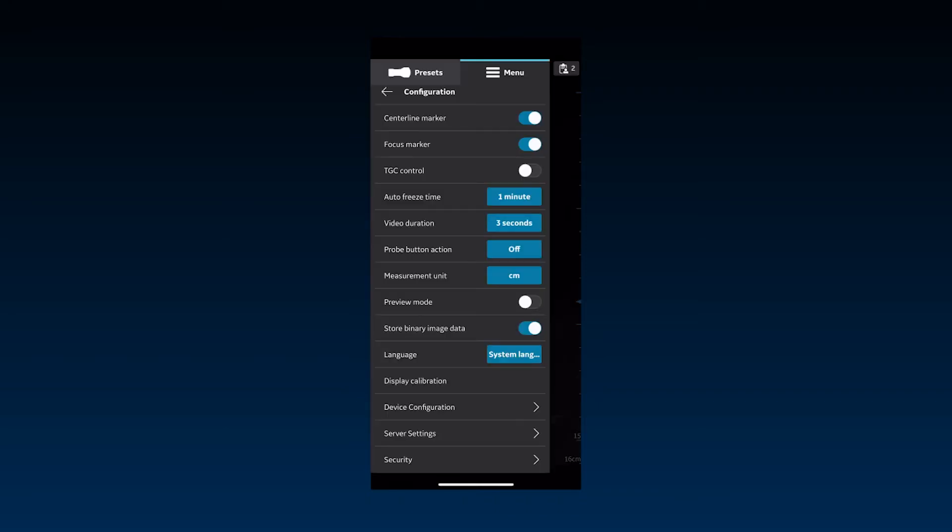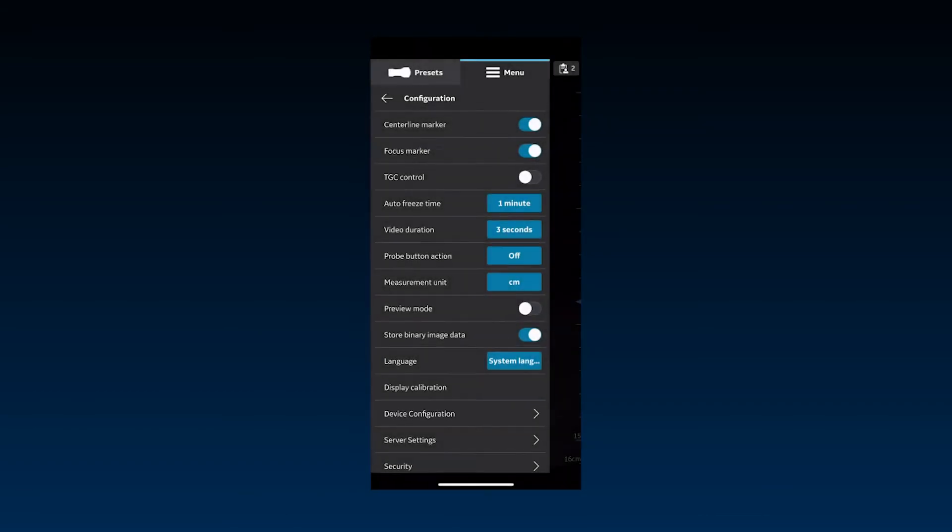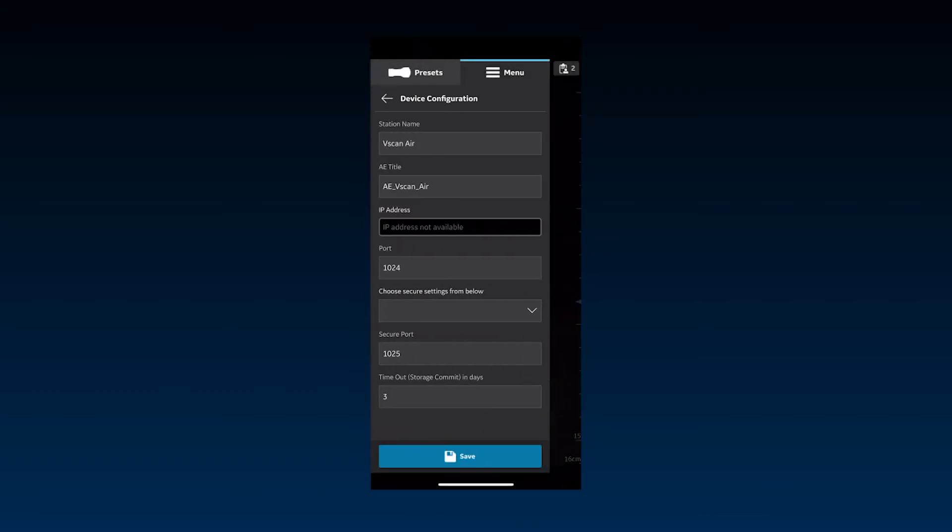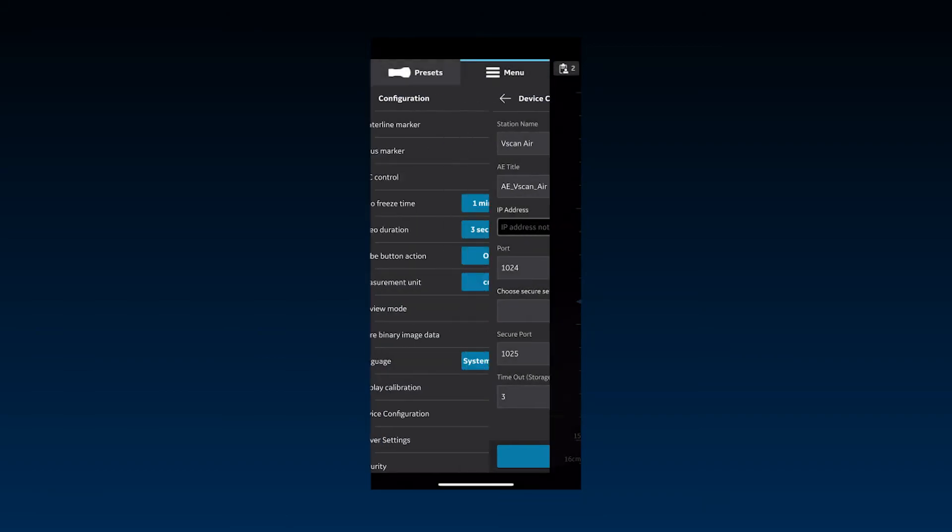To establish a communication with configured DICOM servers, specify or update default information under the device configuration settings. Press Save after making any changes.